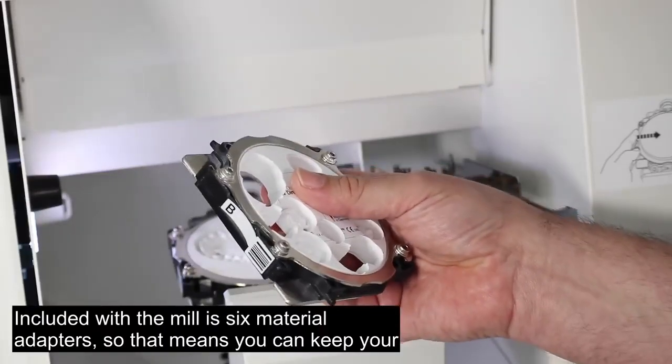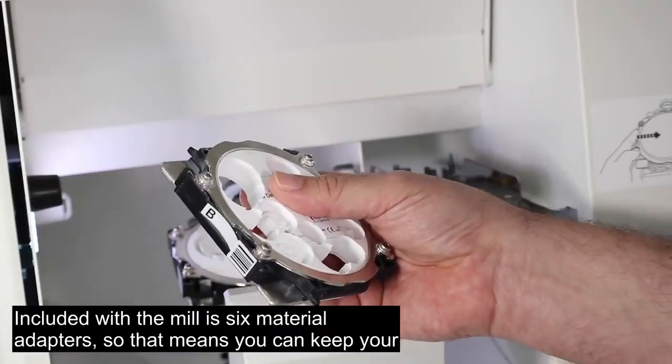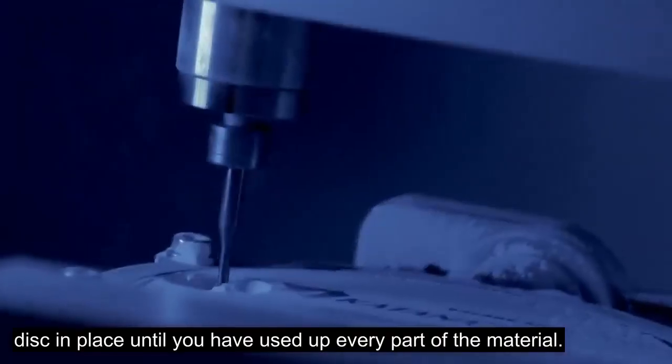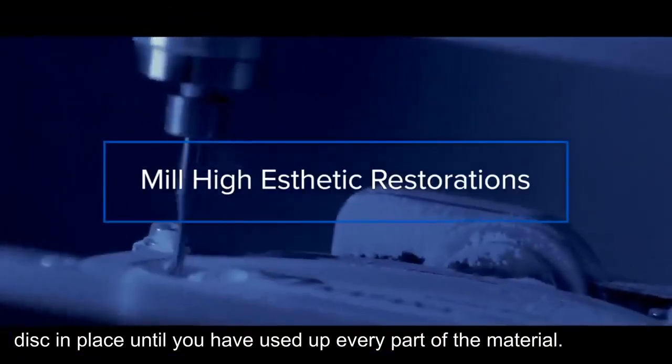Included with the mill are six material adapters, so that means you can keep your disc in place until you've used up every part of the material.